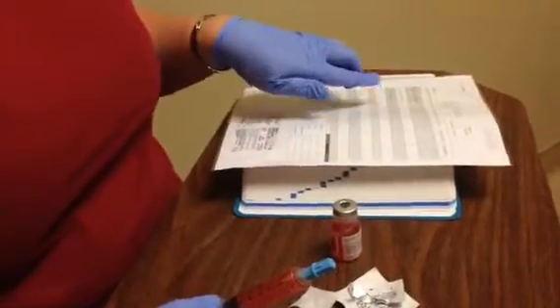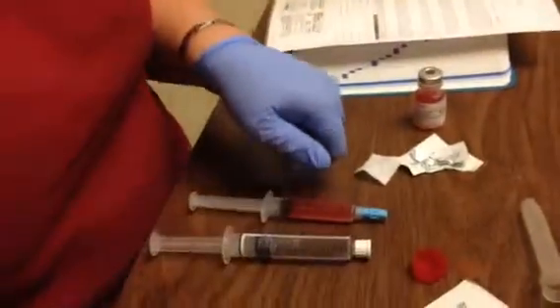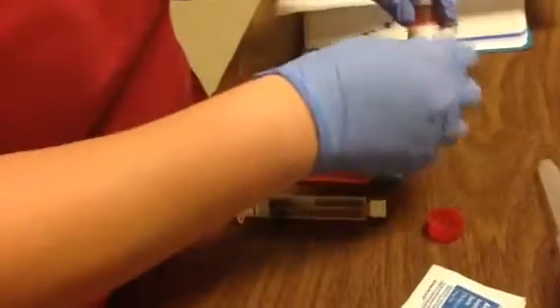I'm going to go ahead and do one more check on my medicine. I've got Demerol 50 milligrams. So I've made sure Demerol 50 milligrams. Okay. I've diluted it in 5 milliliters of saline. So I have a total of 6 in here. Okay. I'm going to take a saline flush with me. I'm going to take alcohol preps.